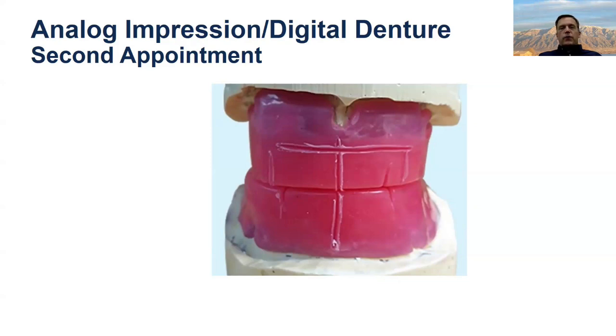Most labs can print base plates, and some labs are doing that, but most of the time, given printer capacity and the like, it's a little bit easier to do a traditional bite block on these cases. You'll go ahead and use all the techniques we talked about before to tell your laboratory what they need to know from the bite blocks. From this point forward, though, the workflow becomes entirely different.